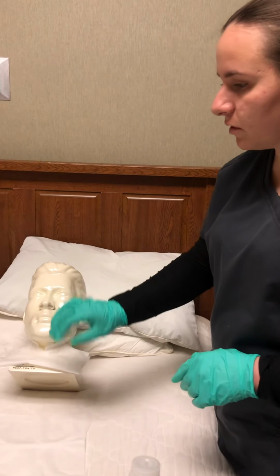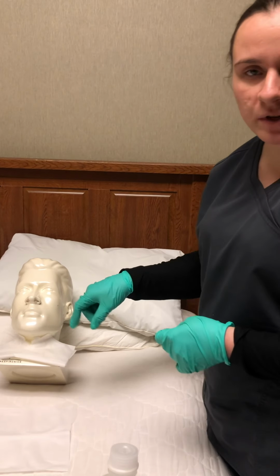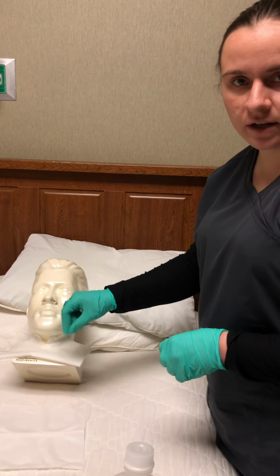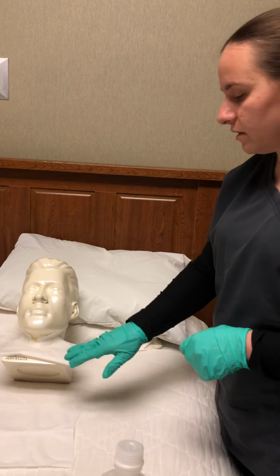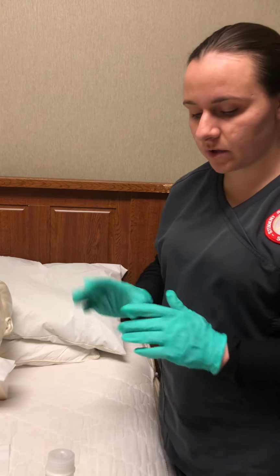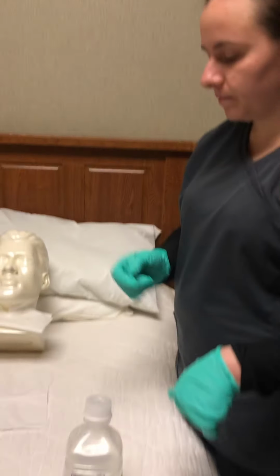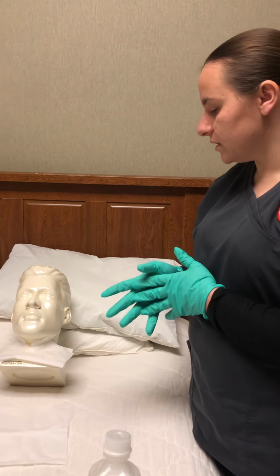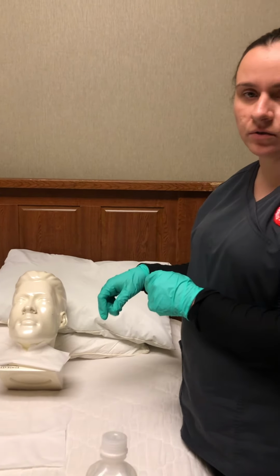After we did that, if they have a disposable inner cannula, you always dispose of the old one and replace it with a clean one, and make sure it's nice and clean before you place it in there. No cracks, nothing that can cause any infection to the patient. When that's all in there and everything looks good, we replace the gauze. Then we make sure everything is disposed of, especially dirty cleaners, anything that needs to be disposed. The other thing is, after we clean out everything, we always need to listen to the trach.